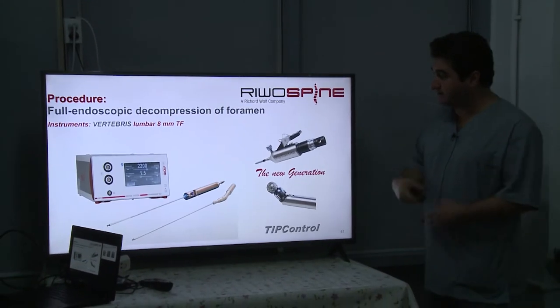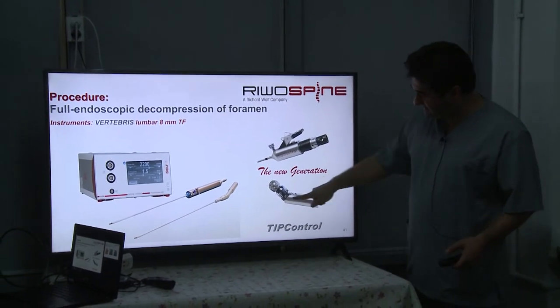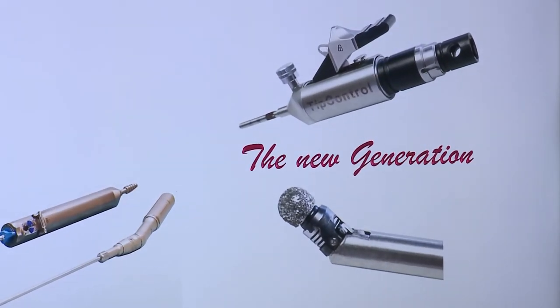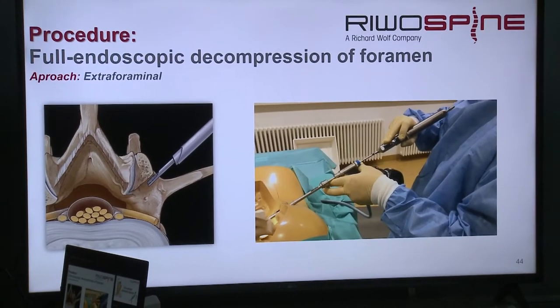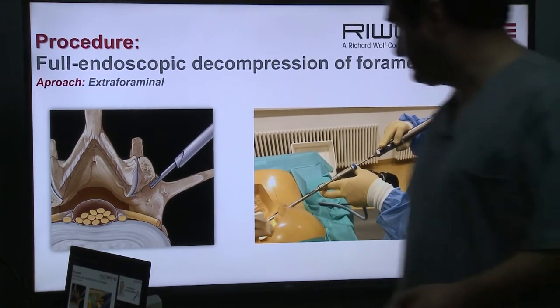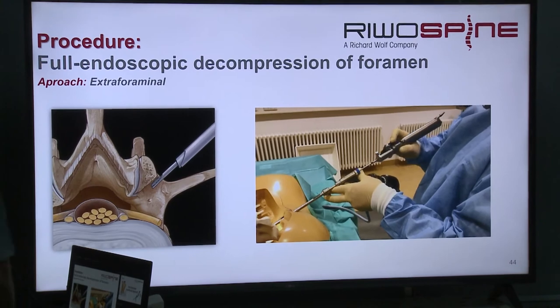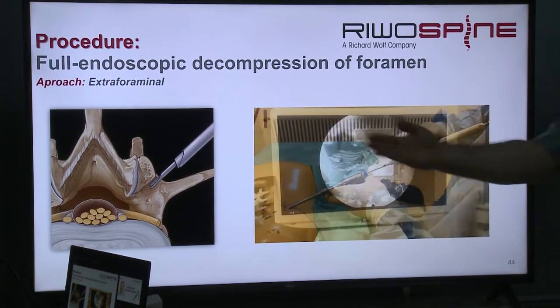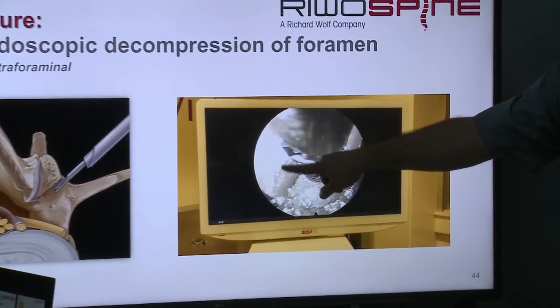Another option is the deflectable one. When you press this button, the tip is deflected like this. This is shaver. This is burr. And how do we do it? Again, the extraforaminal approach, with the endoscope. And then you press the button, and then you can cut the facet joint like this. This is pedicle, and this is facet joint.